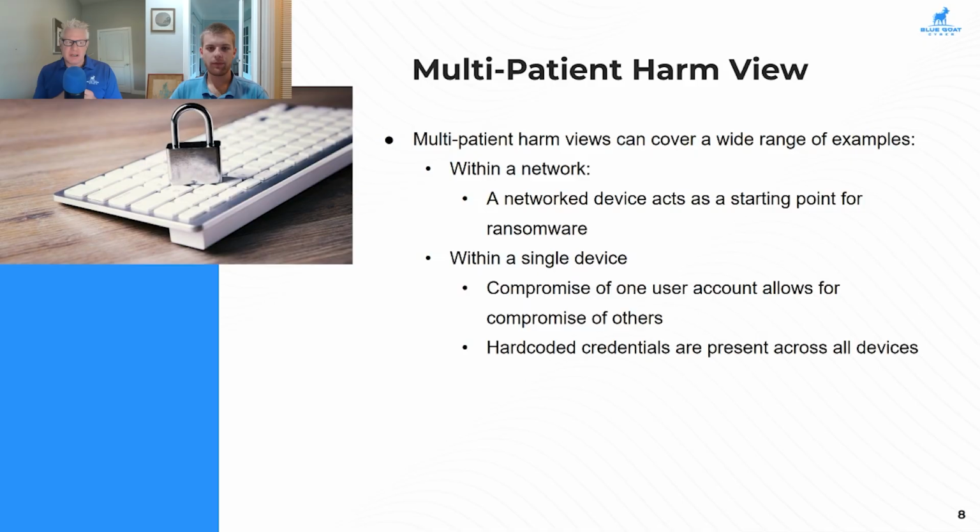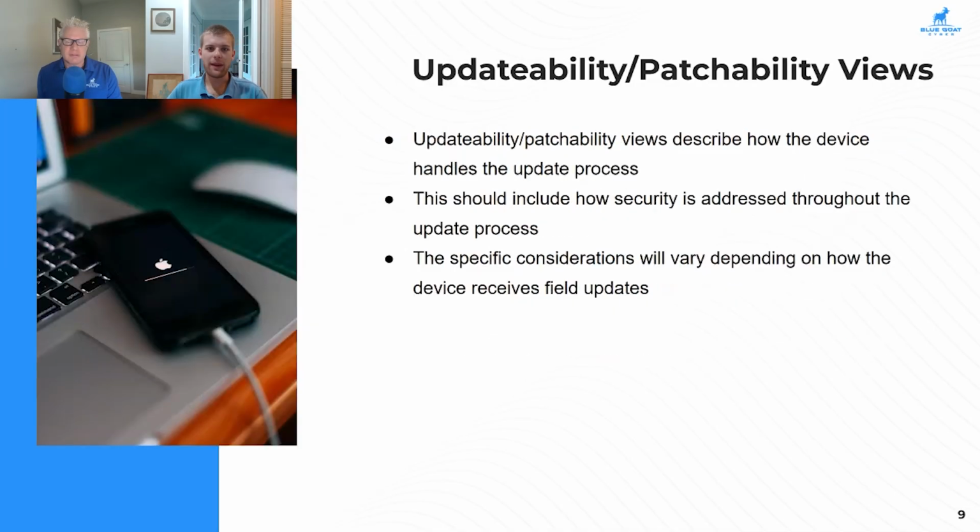Yeah, and that's a good point. The whole reason we're looking at these different views is so we can come up with a solution to minimize the risk. Like you just talked about, the multi-tenant solution for something on the cloud. Yep, exactly. So that's the whole point of this, is to capture different harm scenarios and how they're designed out of the system. We can go ahead and jump into updatability and patchability views.